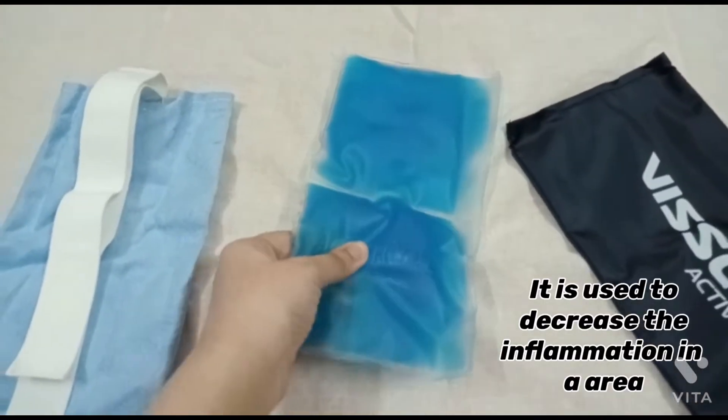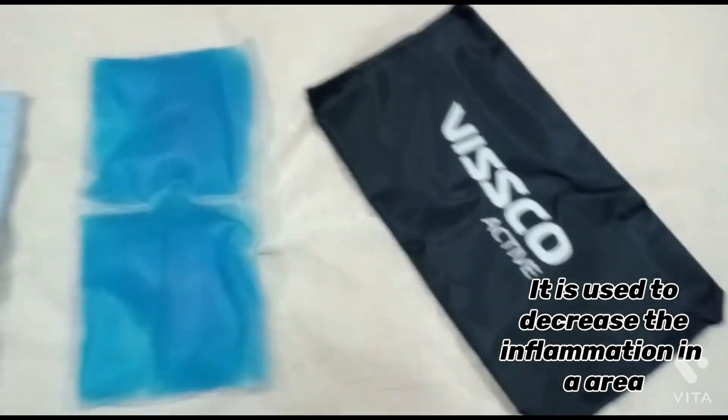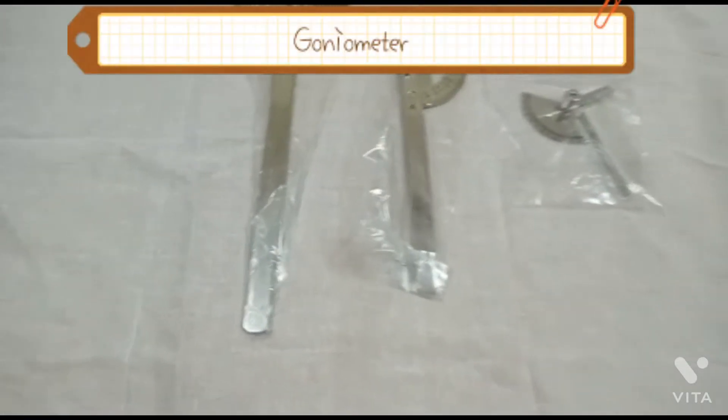The cold pack is used to decrease inflammation in an area.